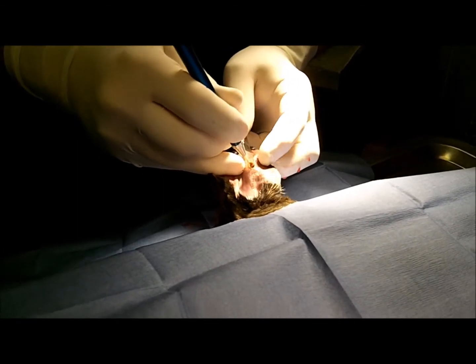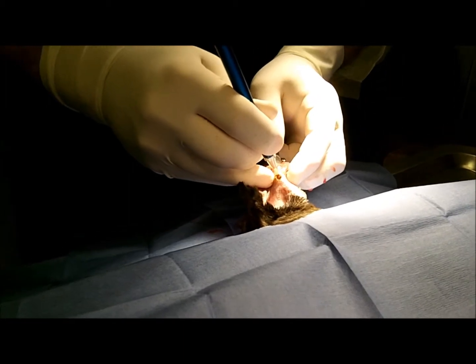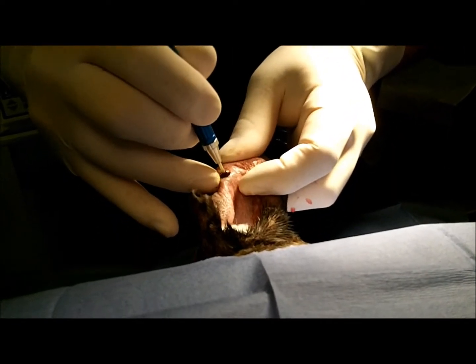I use the scissors to protect the other part of the ear while I'm making a second incision, because I don't want to make an incision all the way through the ear — I just want to make it through this first layer. The scissors make a nice backdrop for the laser, and there we're making a circular incision, a little plug that we're going to take out.